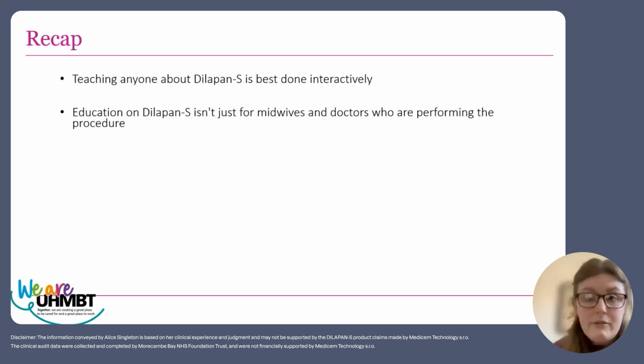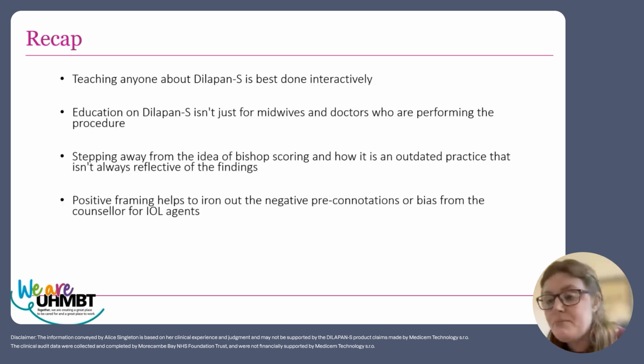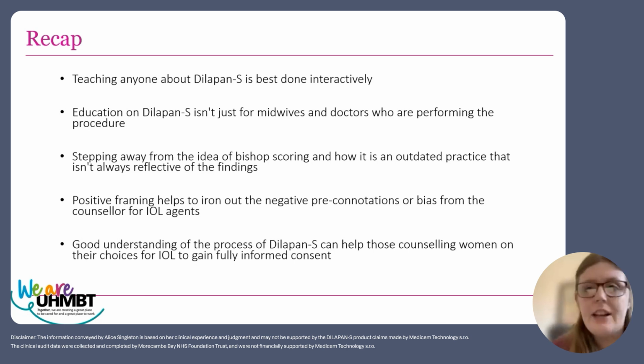So I'm just going to quick recap. Teaching people about Dilapan is best done interactively. Education on Dilapan isn't just for midwives and doctors who are performing it. Stepping away from the idea of Bishop scoring would be really helpful, because I feel like it would make us have a better anatomical understanding of the cervix. It's outdated and isn't reflective of the effects that Dilapan has on the cervix.